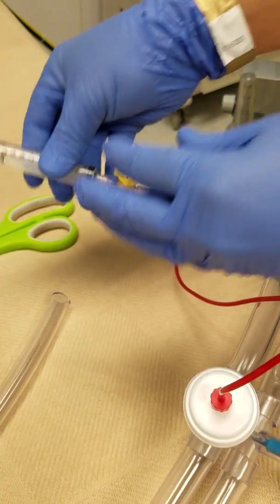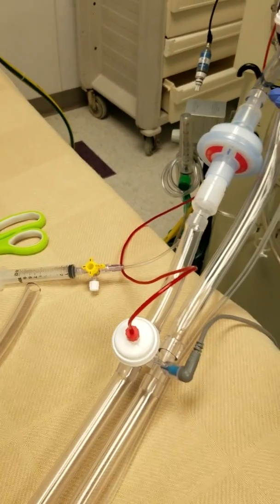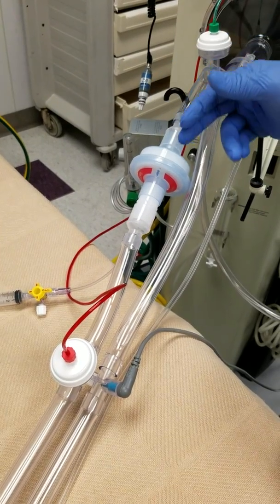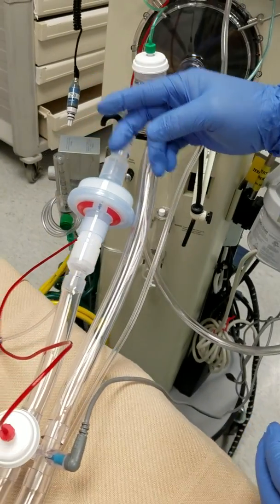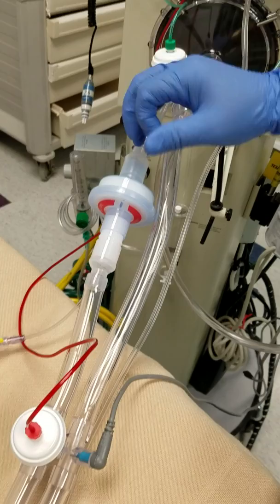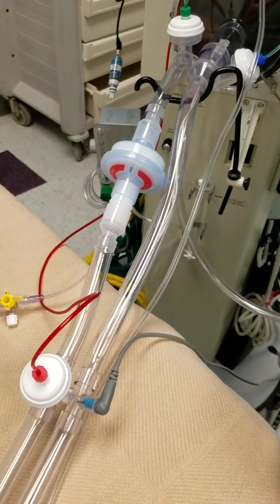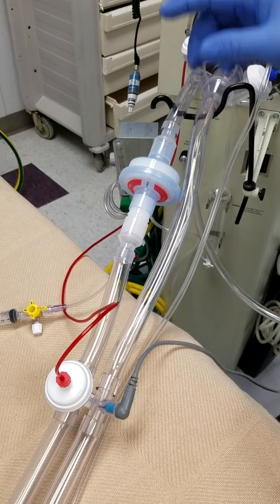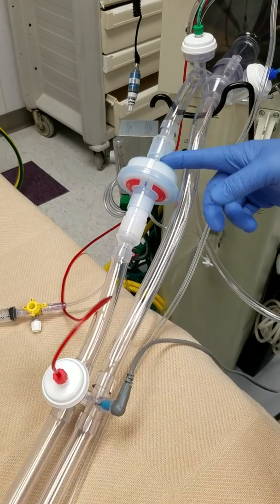If this filter is saturated with water and particles start building up to where you have a hard time maintaining your mean and your delta, that gives you a sign that you need to change this filter.